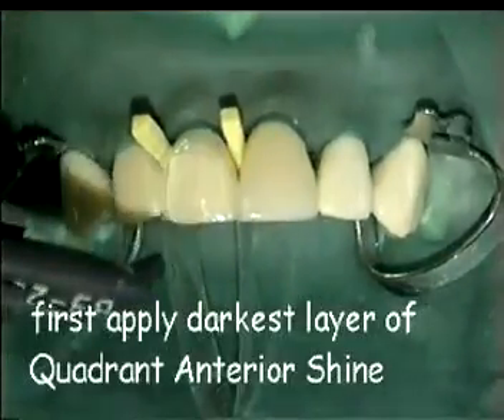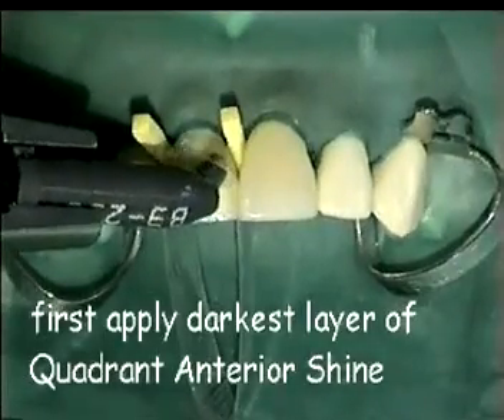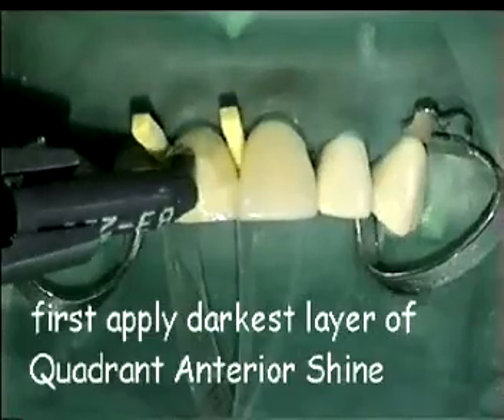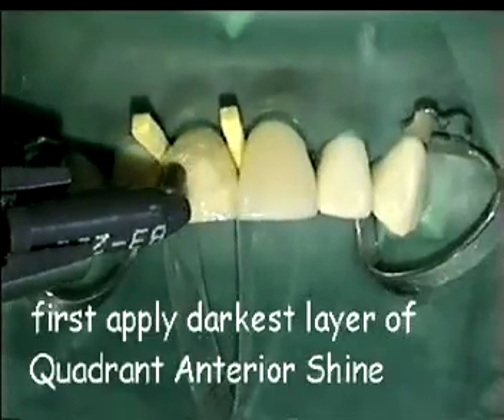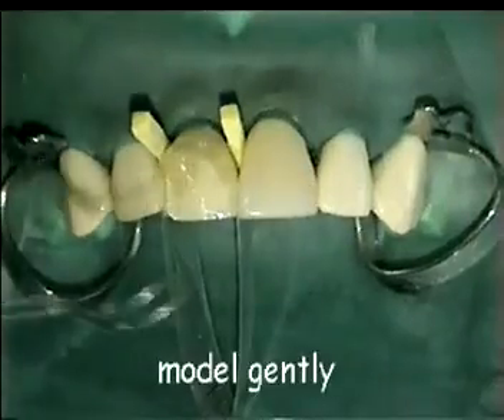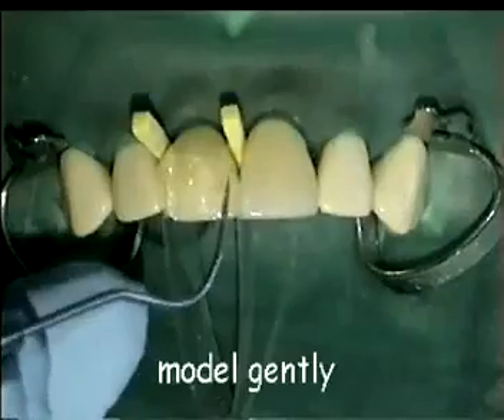Apply the first layer of Quadrant Anterior Shine. Keep the tip in contact with the tooth while smoothly applying the composite to the cervical margin. With an explorer it is possible to gently shape the composite.